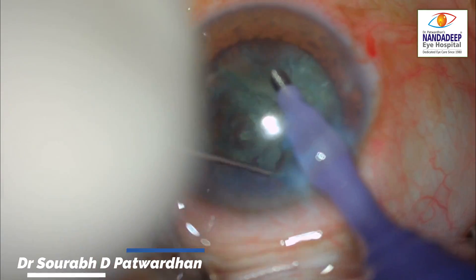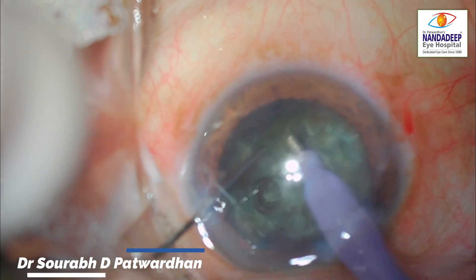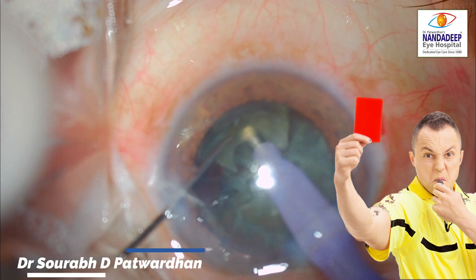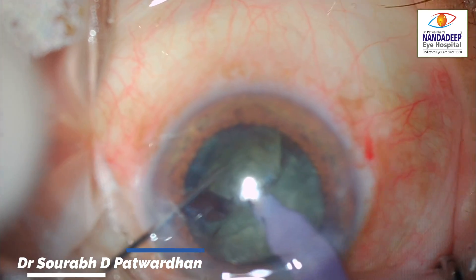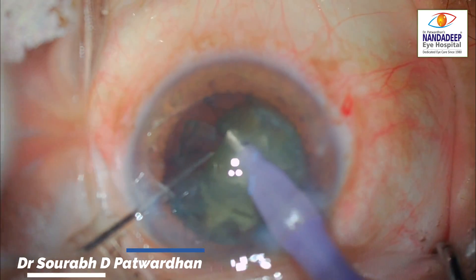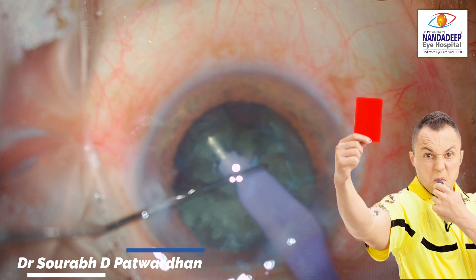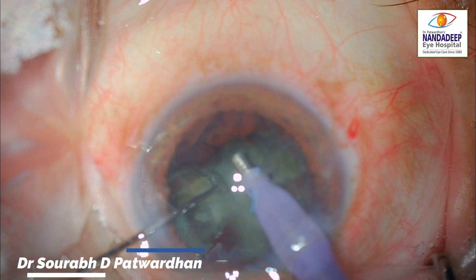The trainee is having difficulty in taking out the pieces from the bag, and he is going into the periphery with the feco probe. The feco tip is leaving the safe zone. We are raising red cards again and again, but fortunately the trainee has not caused any complication yet. He rotates the nucleus and tries to emulsify further, able to take out one small piece. Again, look at the feco tip — still no complication.